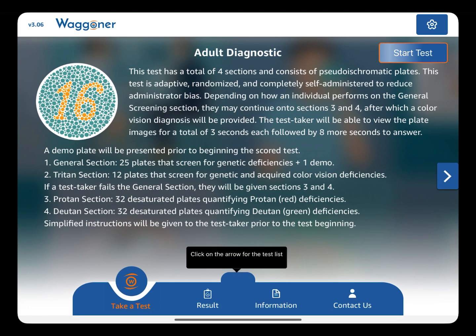Congratulations. You are now ready to test your first patient. Click Start Test in the upper right.